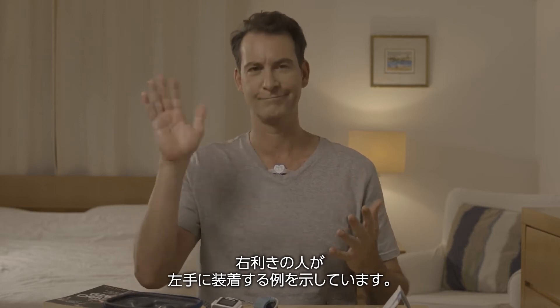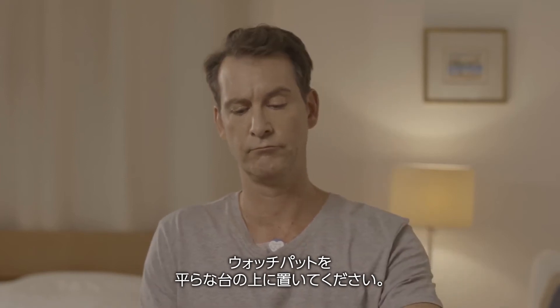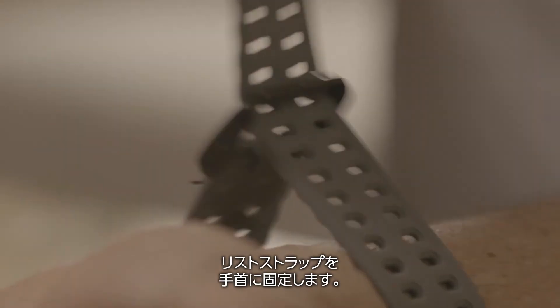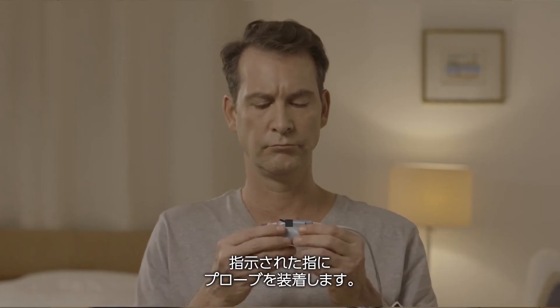Here you see how a right-handed person puts the device on his left hand. Place the WatchPAD on a flat surface, insert your hand, and close the wrist strap, making sure it's snug but not too tight. Place the probe on the finger that you have been told to use.